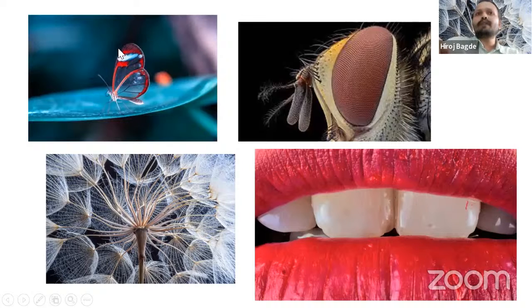So what I have used is an f-stop with a smaller number, like 7, 8 or 9, which in this case is something at a higher level of f22, f32, like that. So we need to incorporate that.